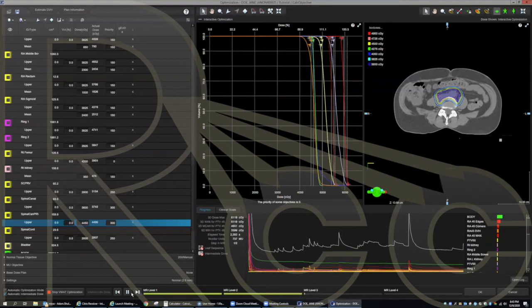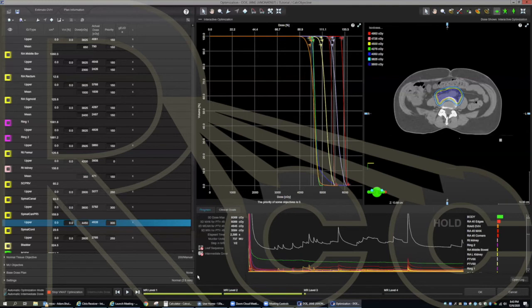And so the idea is, especially if you can get scripting to get these organs at risk, the planning contours, the optimization contours done quickly with a script, and you follow the same template, you can really drive your throughput, limit the number of beams, drive your throughput for patient plans per dosimetrist, and hopefully get high quality plans for your patients.